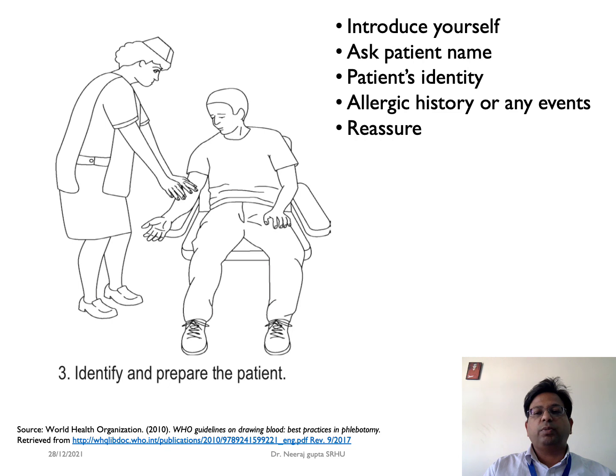Discuss the test to be performed and obtain a verbal consent, which is very important. The patient has all the rights to refuse a test at any time before the blood sampling. So it is very important to ensure the patient has understood the procedure.